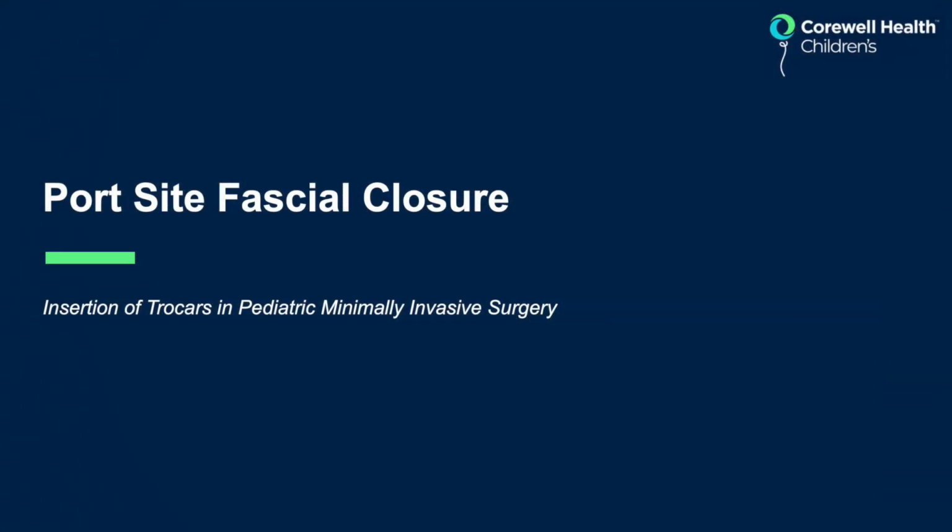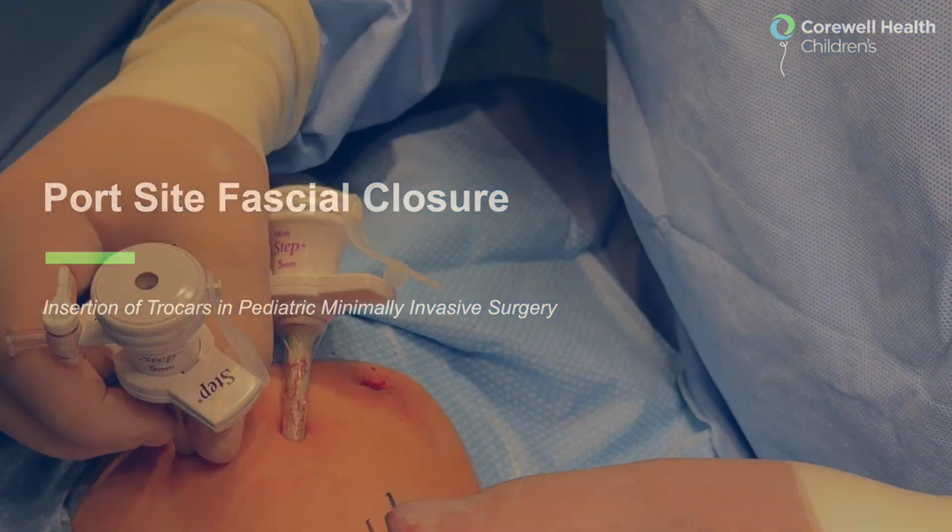Here we describe port site fascial closure using a groove director. Children, especially those younger than 5 years old, are at higher risk for port site hernias than adults. Due to thinner abdominal walls, defects created by angled port placement in children are not offset as much as in adults and provide less protection against hernia formation. Fascia should be closed for all port sites in children due to this increased hernia risk.